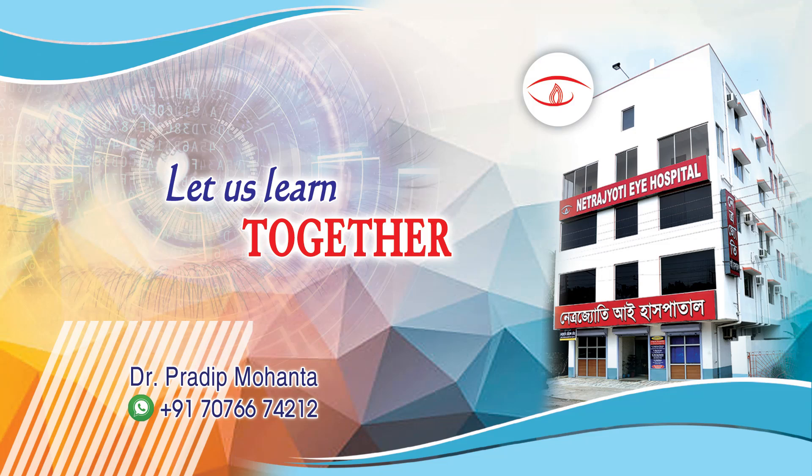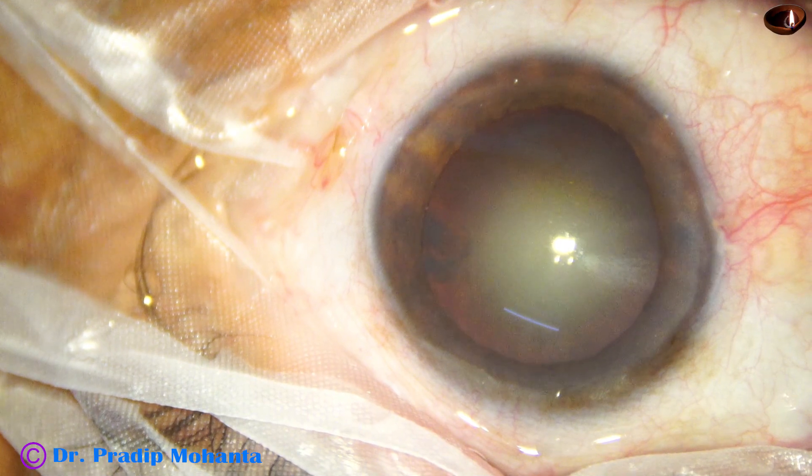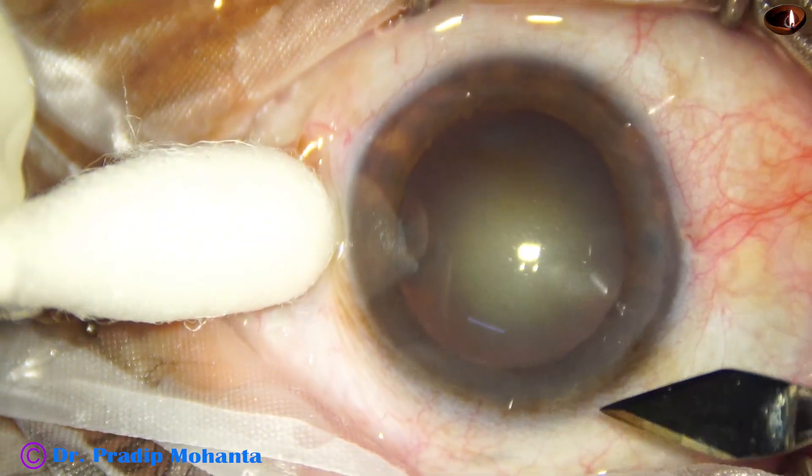Let us learn the stop-and-chop technique of phacoemulsification. This is a cataract with grade 3 nuclear sclerosis. Let us observe the surgery.